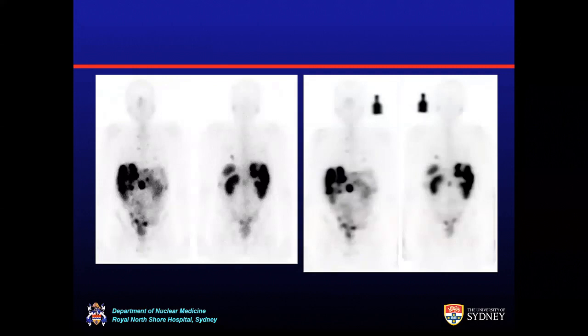This patient also has a similar issue in disease localization of the liver. Here we can see quite a lobulated pattern of uptake within the right lobe of the liver, this time convincing that there is more than one lesion. However, it is impossible to specifically count the number of lesions on the true planar images, and therefore correlation with SPECT CT images would be the gold standard here.